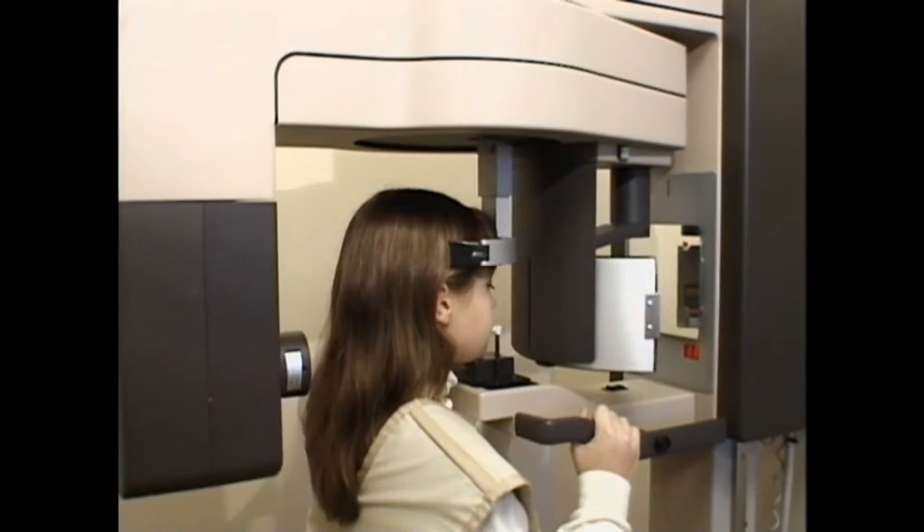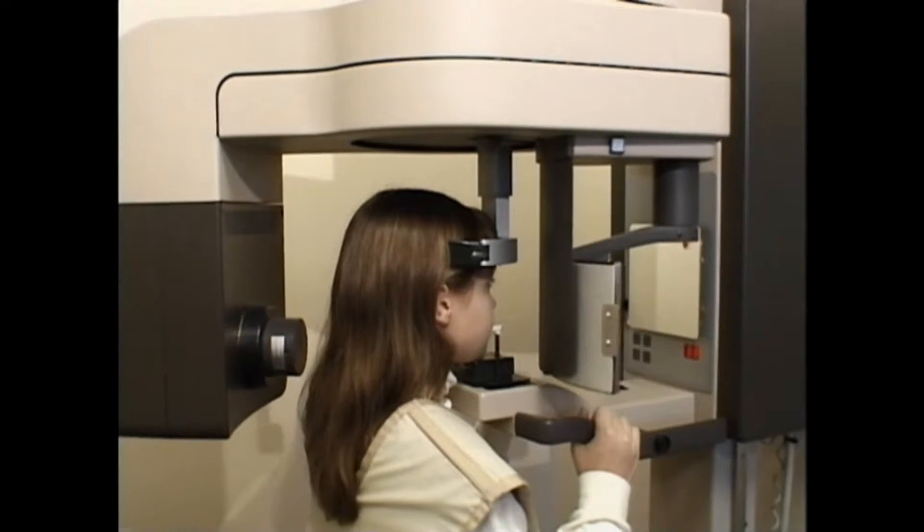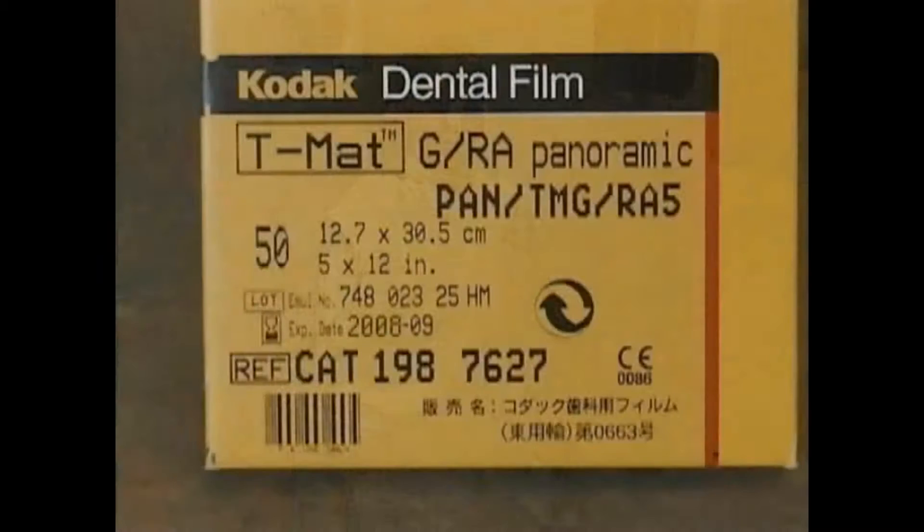The x-ray film is positioned outside your mouth, and the x-ray head rotates around you. The lead apron protects the rest of your body while we take x-rays of your mouth. Dental x-rays use high-speed film, so the amount of radiation exposure is very low.